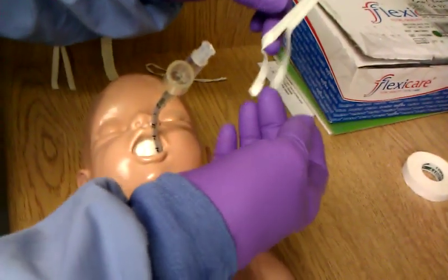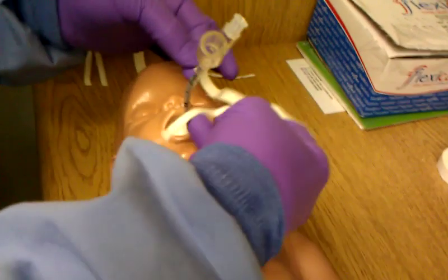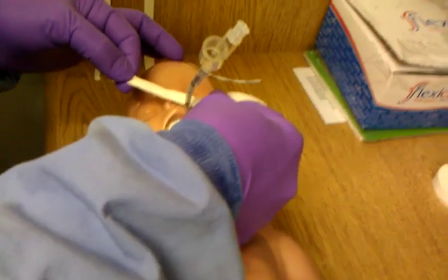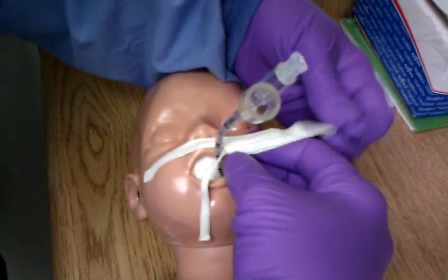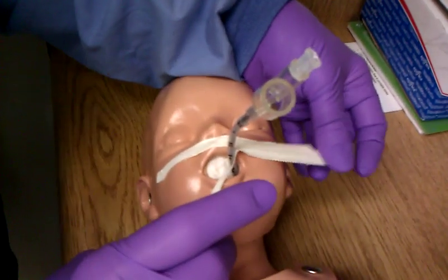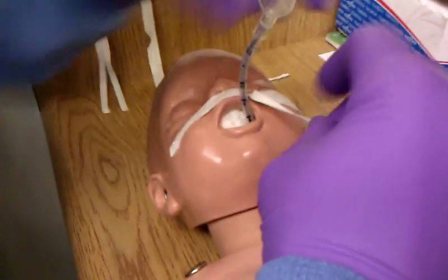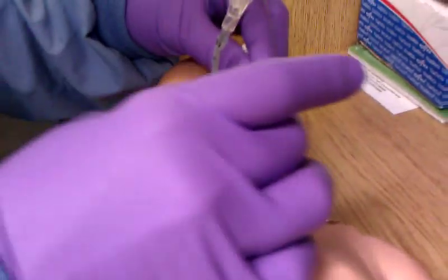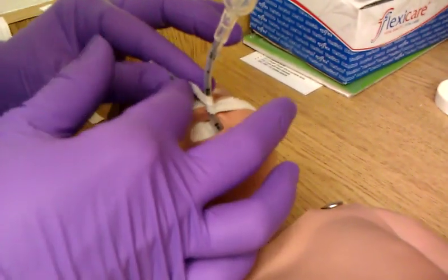You're going to take your first piece of tape. Make sure you have someone secure the tube, holding the tube in place. The tube needs to be very close, right up against that split in the tape. And then you want to take the bottom part and go nice and snugly around the tube.